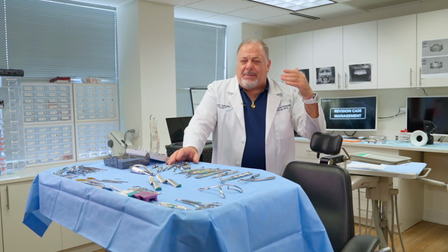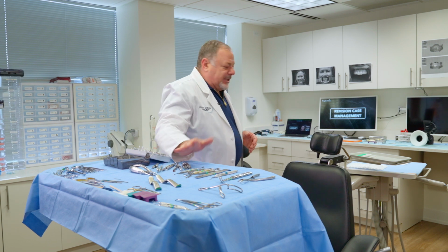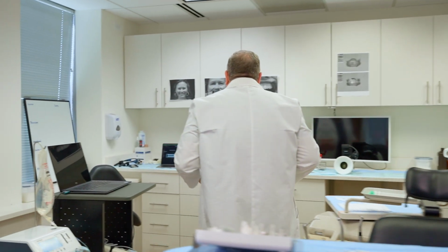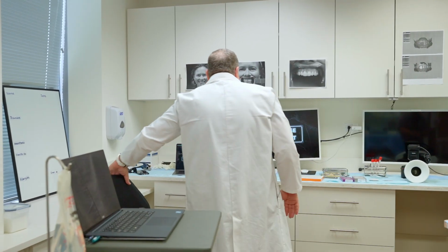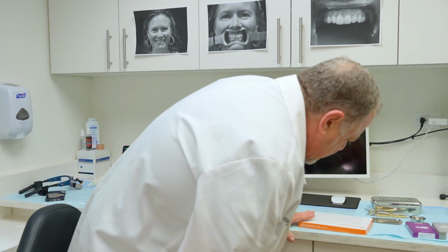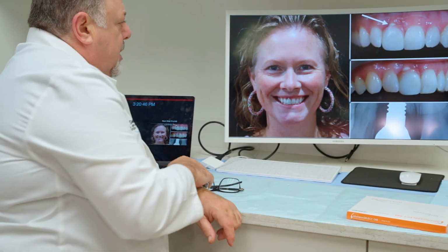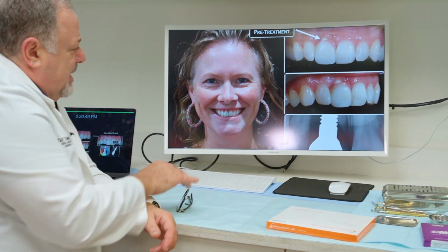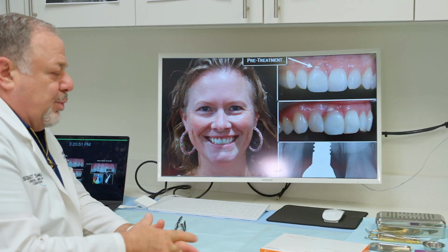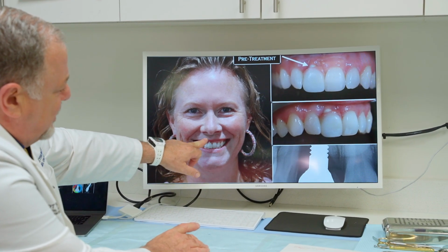So let's come on over here to the monitor so we can look at this. And again, we talked about a tunnel kit, so let's come back and go through this case so we see what the different aspects of it are going to mean, okay? So here is our patient, Jen. Okay? So Jen is a very, very pretty girl. She's got a really high smile line. And you can see as she smiles, she's showing her gingival display, okay?